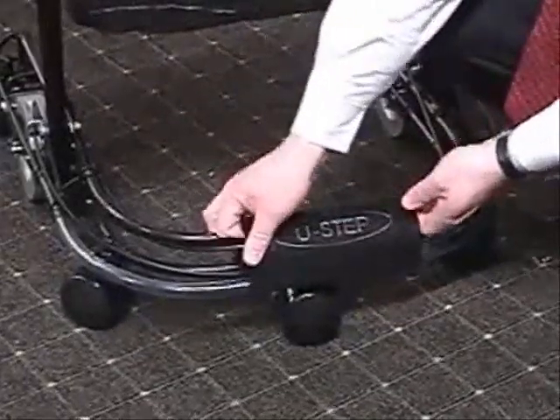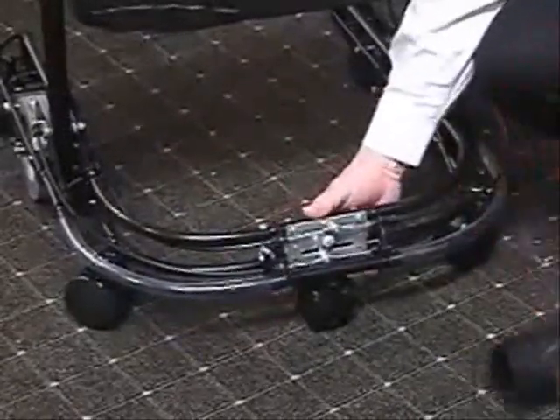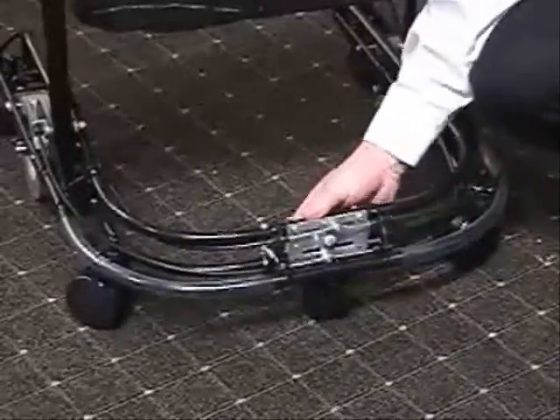The U-Step also has a front-loaded spring wheel. This allows the unit to easily ride over bumps and cracks, such as molding strips and cracks in the sidewalk.